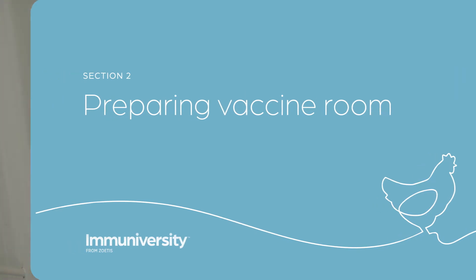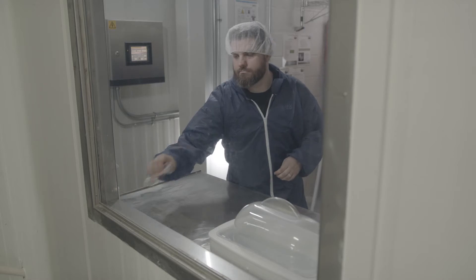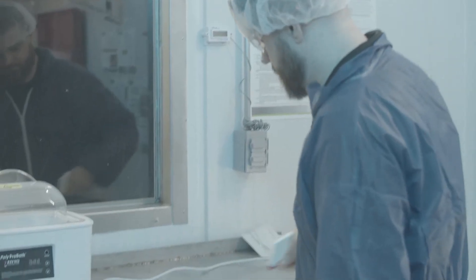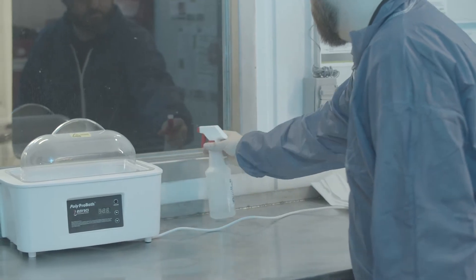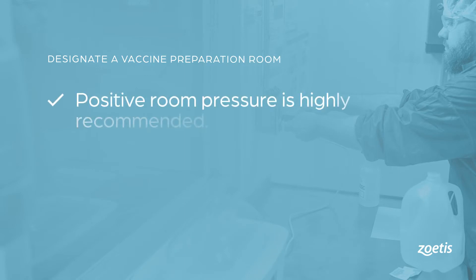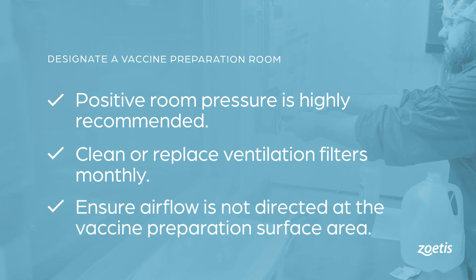Designate a vaccine preparation room in a controlled work area of the hatchery. Only vaccine personnel should be permitted entry, and the space should have a daily, weekly, and monthly cleaning schedule to ensure the environment is the cleanest room in the hatchery. Positive room pressure is highly recommended. Clean or replace ventilation filters monthly and ensure airflow is not directed at the vaccine preparation surface area.